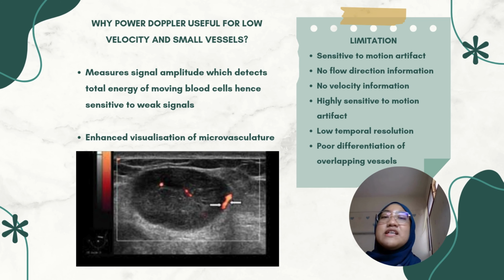However, it also has its own limitations. Firstly, it is very sensitive to motion artifact. It has no velocity and also no directional information. It has low temporal resolution and also poor differentiation of overlapping vessels.